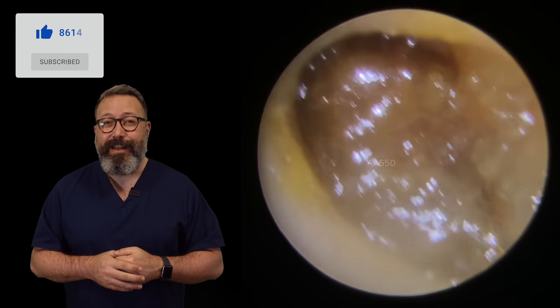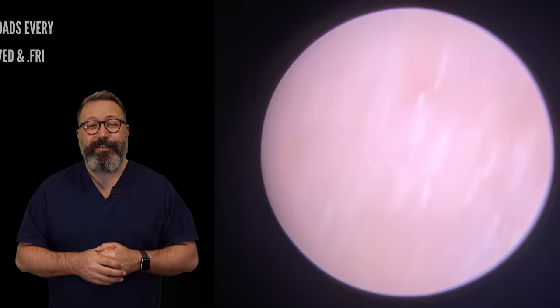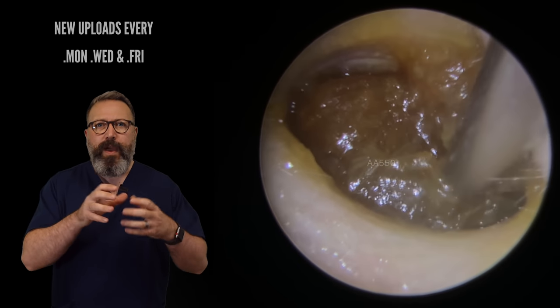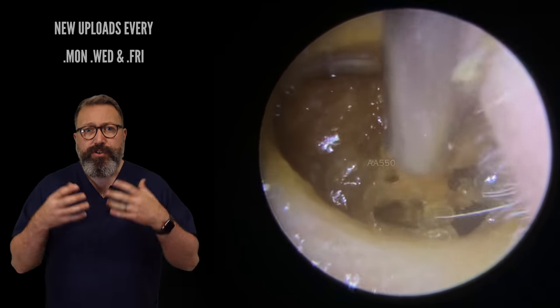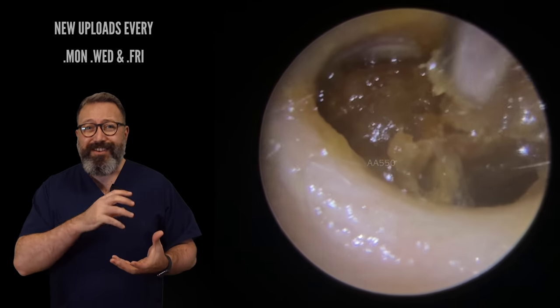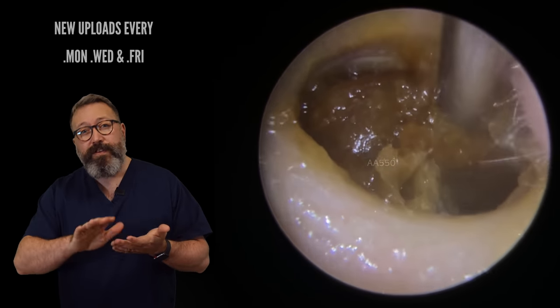I've forgotten the rulers in that particular clinic, so I couldn't give you the ruler shots on that one. So this is the second patient in the compilation — very, very different wax, this one. Very soft. The patient's been using some olive oil to soften this up. So we're using the suction tube here just to remove that surface soft wax.